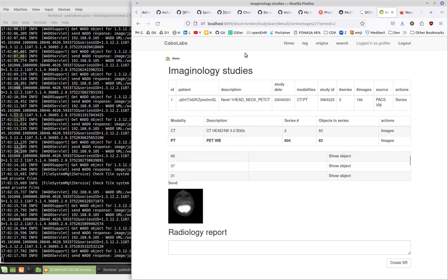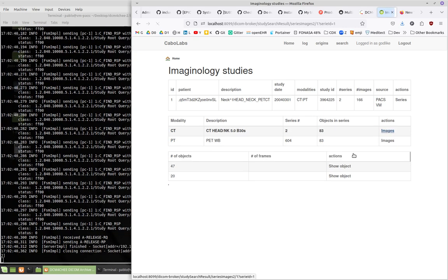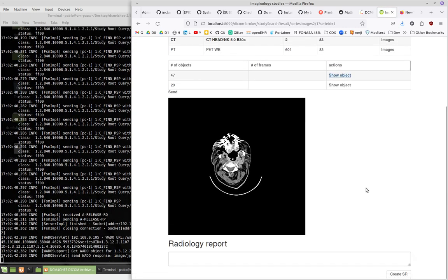And the point of this application is just for training, is to display the images and also to assign or create a report. So if I can, for instance, choose an image from the other series, the big ones, yeah, and say, one nice thing about this image is the patient has amalgams on his or her teeth.